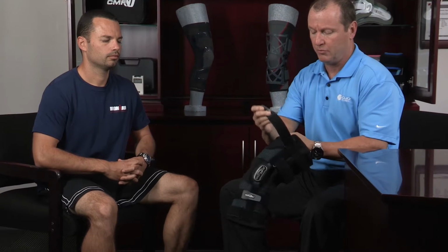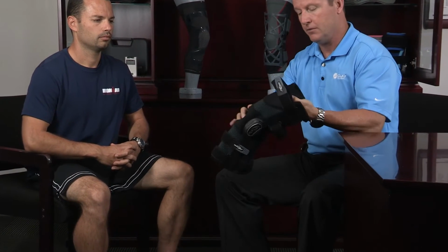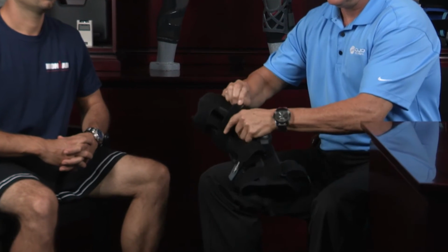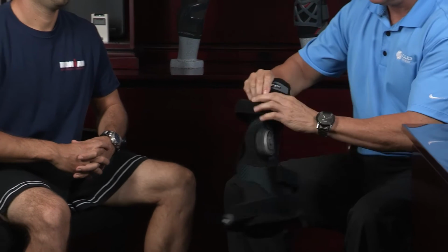Okay, I'd like to go over the application of the Playmaker II Force Point. If you've ever worn a functional brace before, you know sometimes the Velcro straps can get in the way a little bit when you're putting it on. One recommendation is to loosen the straps up a little bit here, so that when you're sliding it on, the Velcro doesn't get on your shirt, and it's a lot easier to apply the brace. And I've got my favorite athlete here, Nick Gomez, who's going to show us exactly how to put this on.